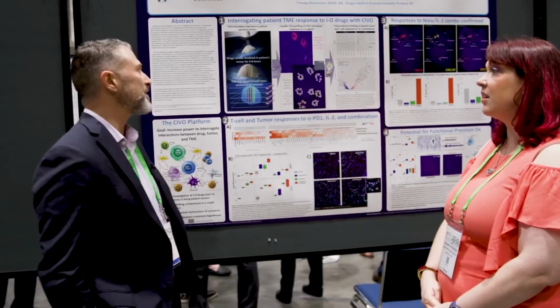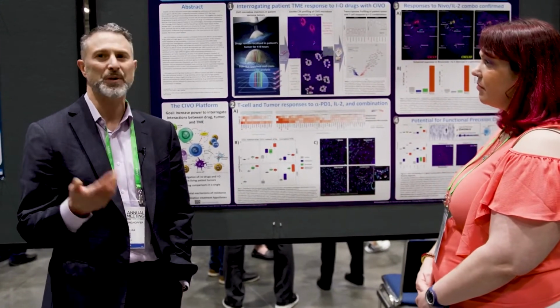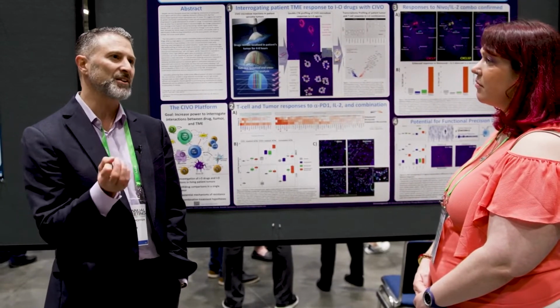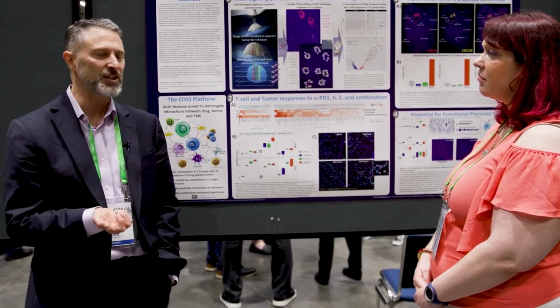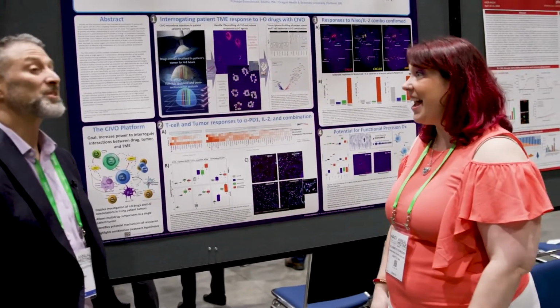They would. Now that we have established the technology with our 1st generation device, of course, we're working on new iterations, 2nd generation devices. Our next generation, which we call our deep reach device, where all the needles are encased in a 16 gauge introducer, is now in canine studies. Oh, excellent. Nanostring, as you may or may not be aware, actually has a canine immuno-oncology nCounter panel. Oh, yeah, that's fantastic. What's really interesting, for the viewers who are watching this live, is that a lot of canine oncology patients are not actually lab animals.